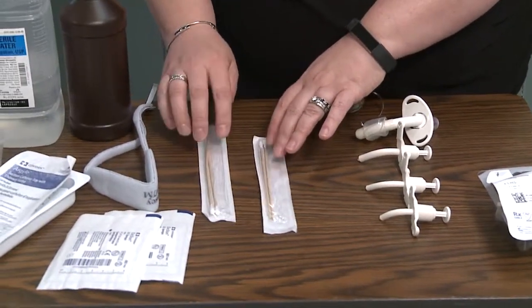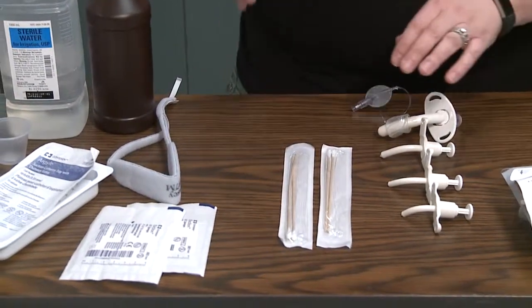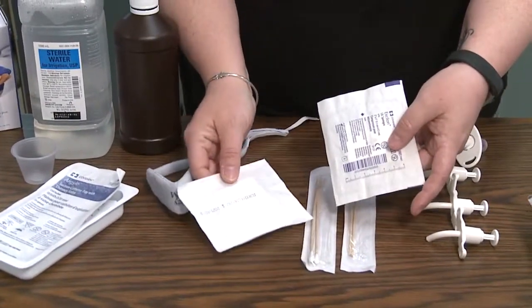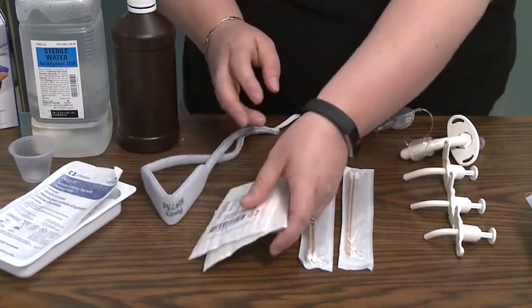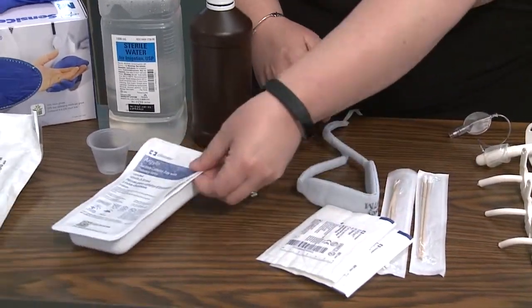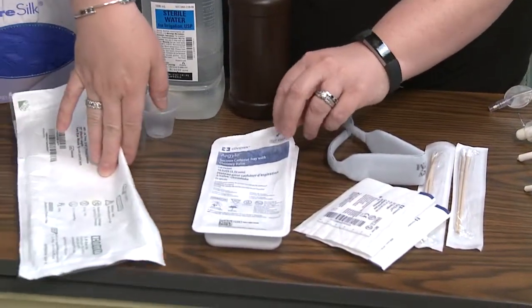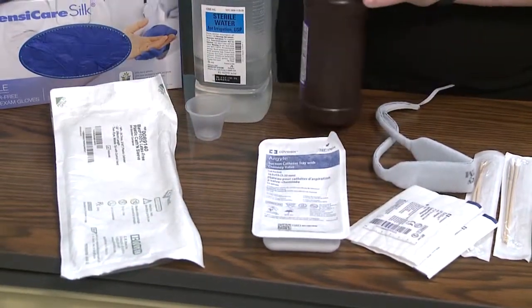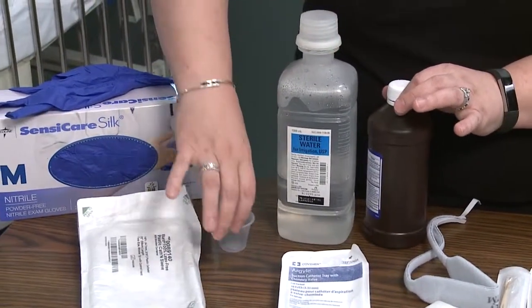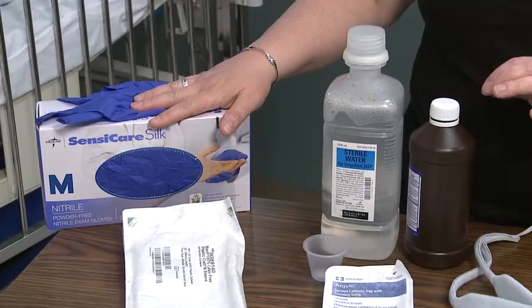When you're doing trach care, you would need sterilized q-tips, some drain sponges, a new trach tie perhaps, different kinds of sterile catheters for suctioning, hydrogen peroxide, sterile water, cups to mix that in, and of course your gloves.